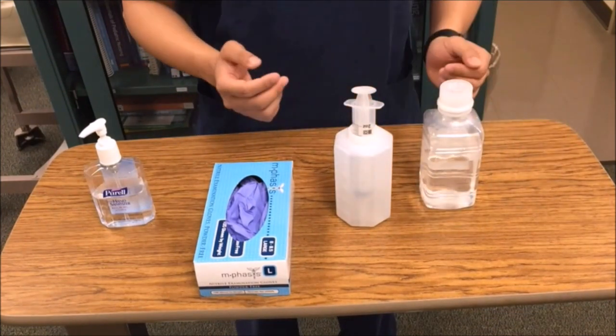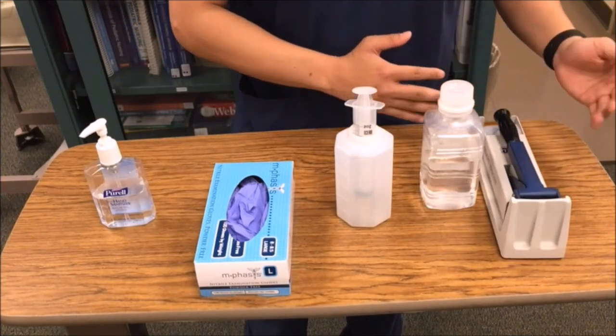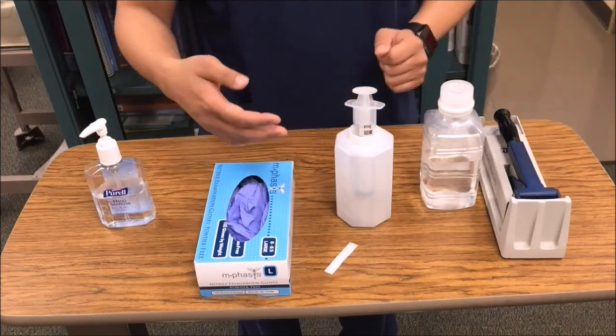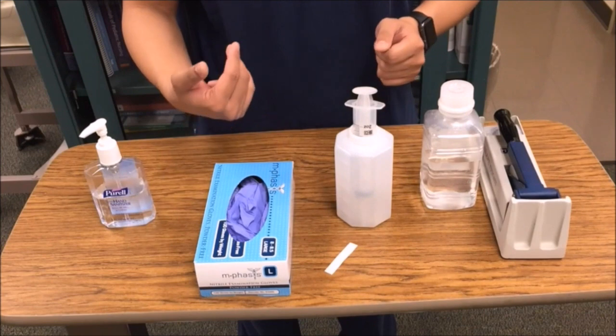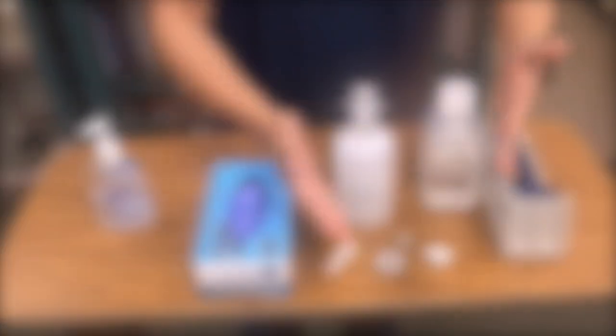Sterile or tap water — to dilute our medications and to flush our tubes to maintain patency. Our pill crusher — this is to crush our medications. Litmus paper — this is to check for tube placement. The paper should turn red or pink to indicate acidity of contents. And, of course, our medications.